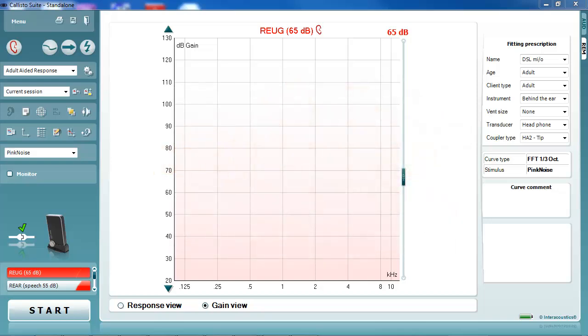As a default, the Affinity and Callisto perform REM by using the active reference method. However, to fit an open-fit hearing aid, one must firstly switch to the stored equalisation or substitution method.